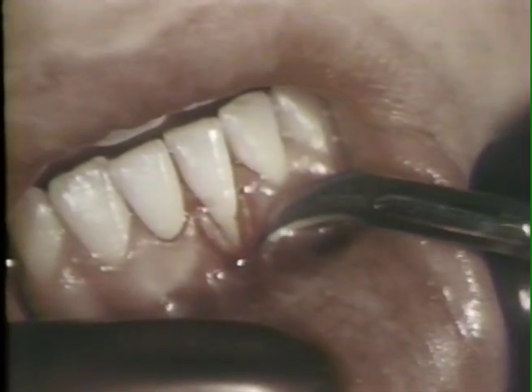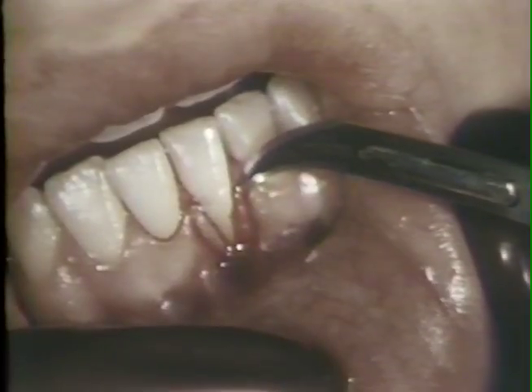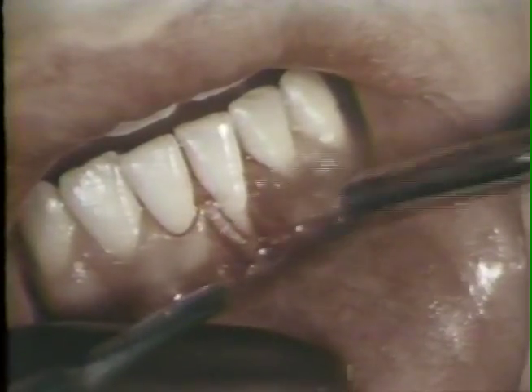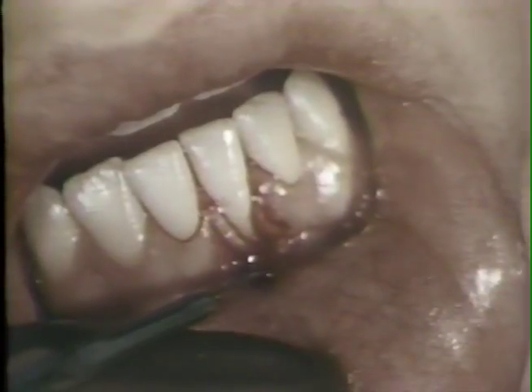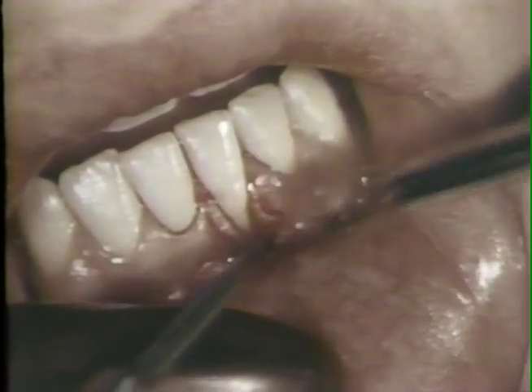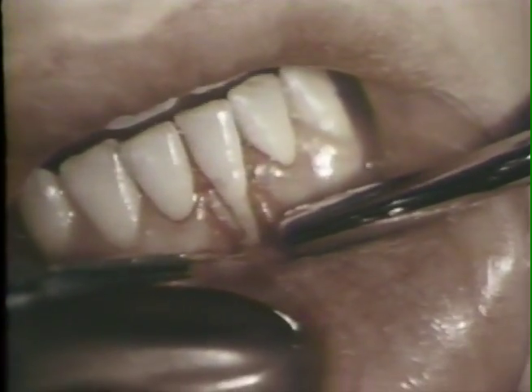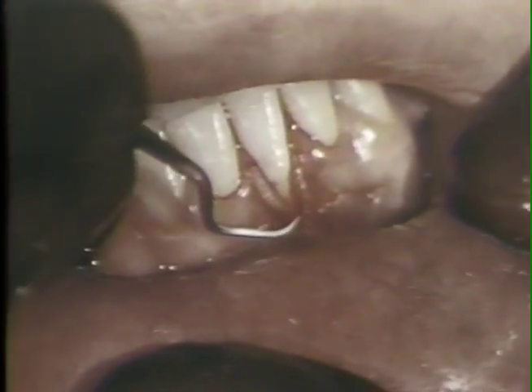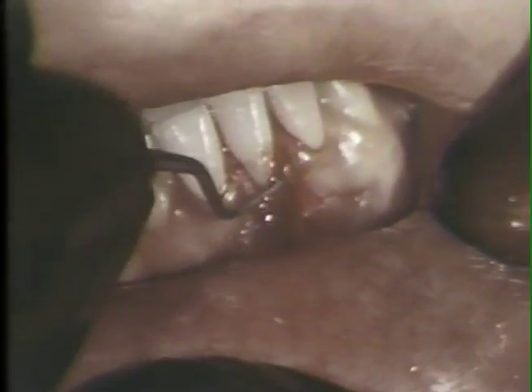These incisions extend into the alveolar mucosa. Then an incision is made around the apical border of the cleft, excising the epithelial lining of the free gingiva. The excised tissues are removed with a curette, and the crevicular areas are curetted to assure removal of all epithelium.